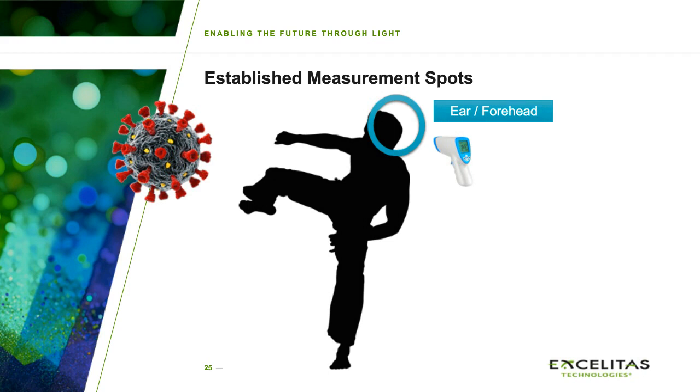Next question: wouldn't more pixels help to increase the accuracy? Yes, the more pixels you have, the smaller the measurement spots are. So indeed, I would also be in favor of having more pixels and smaller pixels. However, as I said, the smaller the pixels, the less signal-to-noise performance you typically have, and the system cost increases.